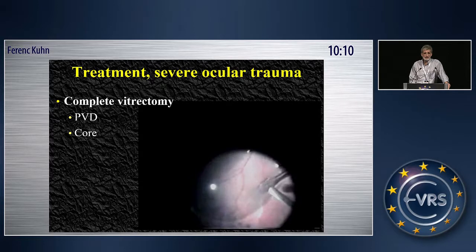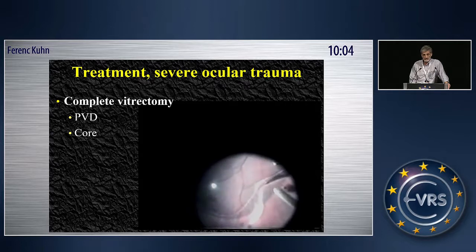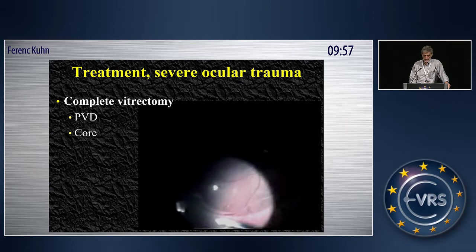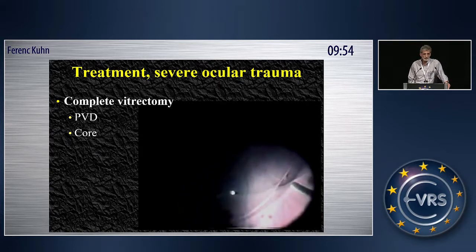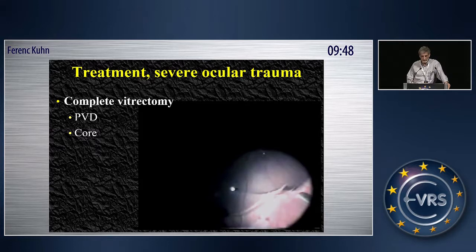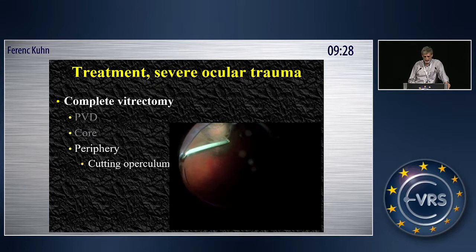One thing which is crucial is to do a complete vitrectomy, and that includes PVD. Usually it's an easy or fairly easy procedure. This short video shows one of my cases where PVD proved to be impossible. No matter what I did — putting heavy liquid on the retina — instead of stabilizing the retina, the vitreous actually cut into the bubble and detached the retina under the heavy liquid because it was so adherent. So it's not always possible.